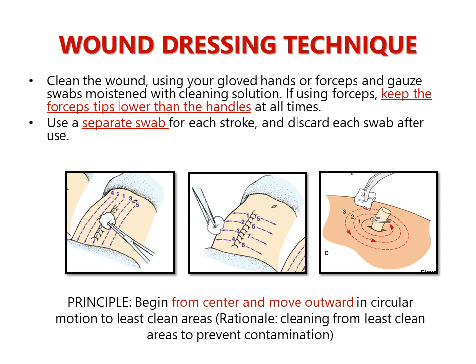The second photo is another way of cleaning the wound, but still the principle says begin from the center. That's why you see the arrows starting from the center, going outside. The principle is also applied if the wound is like photo number three. See? The cleaning of the wound starts from number one in circular motion, moving outward.